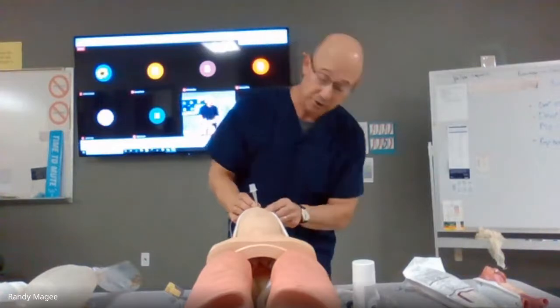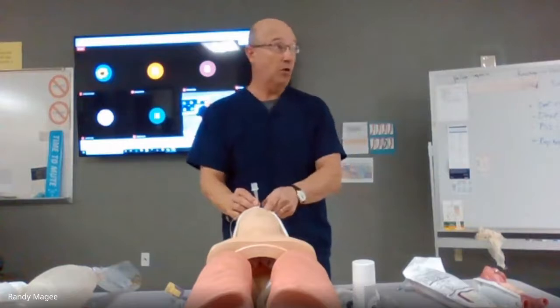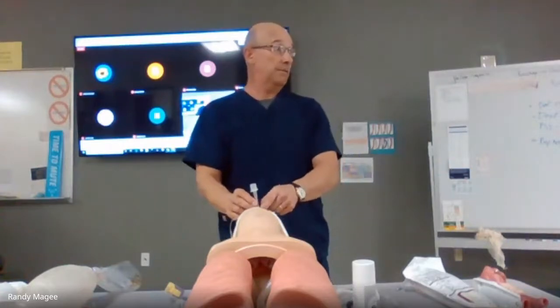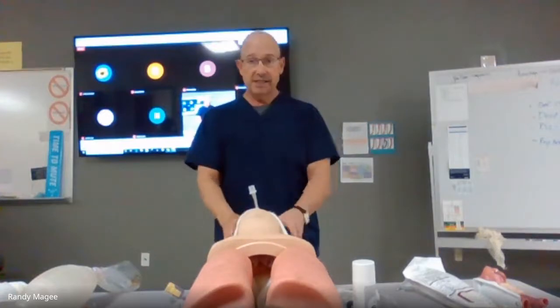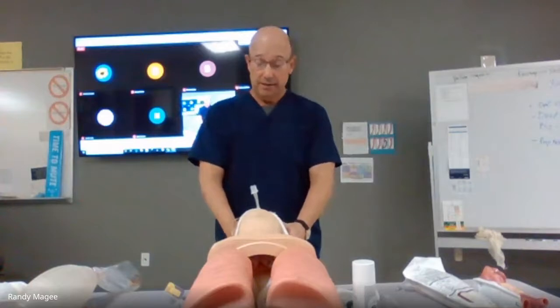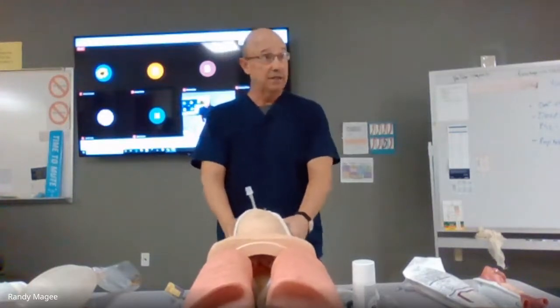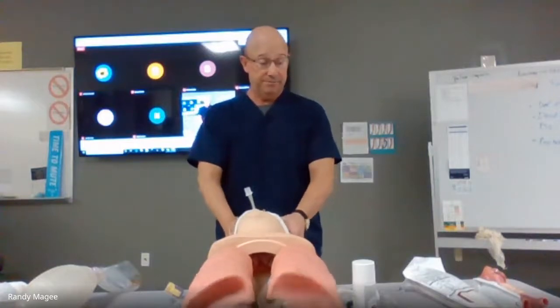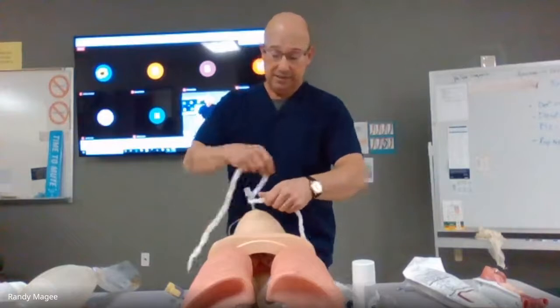Like if it's marked at 22 centimeters, and all of a sudden now it's 24, it's moved, right? So I need to replace the tube. And it doesn't take much for the tube to become dislodged. So I would go ahead and secure this patient's head so the head doesn't move right to left or up and down. Okay. And that's the intubation.